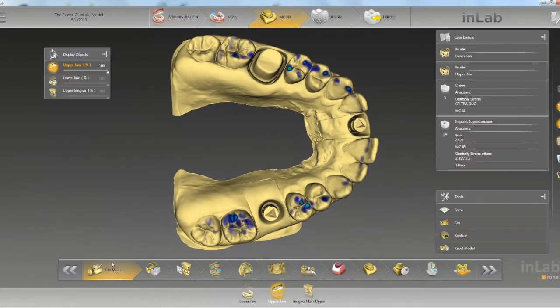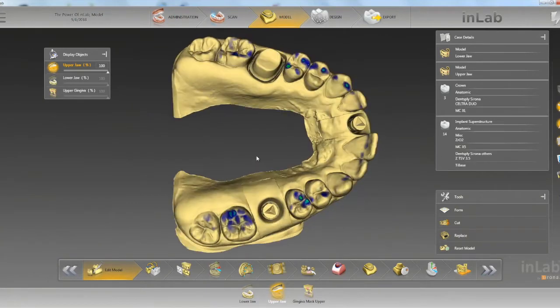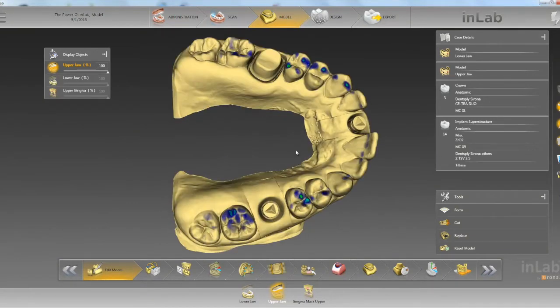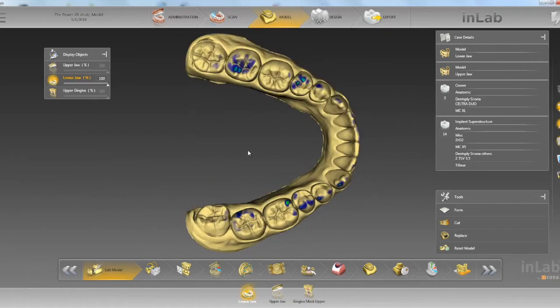First thing you want to do is definitely edit your model as best you can if you need to — if anything's hanging off, go ahead and cut it here for your upper and lower.